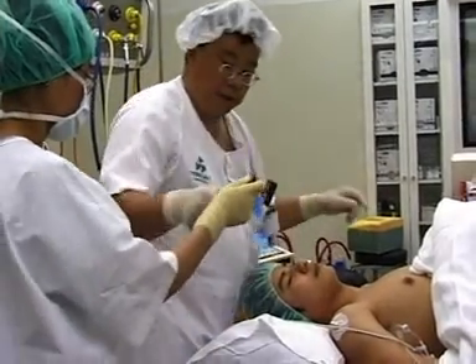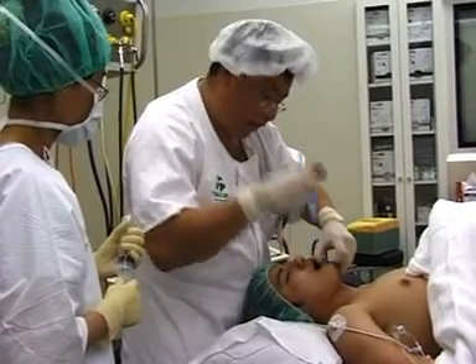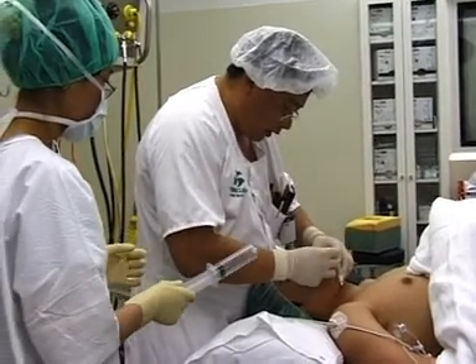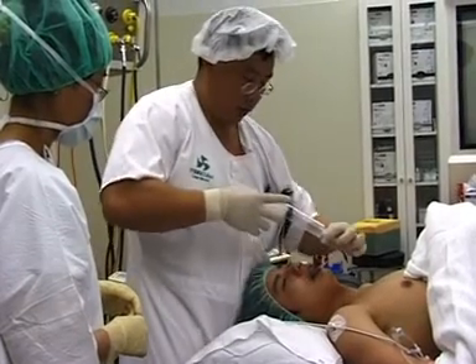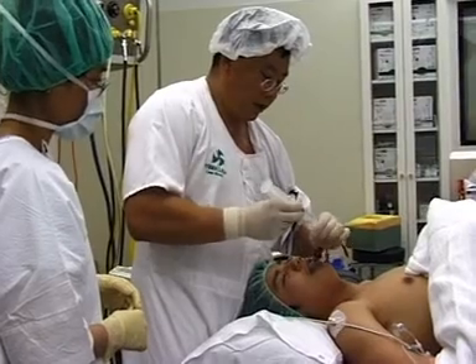What we do is we grasp the jaw and put the laryngeal tube in. Grasp the jaw and lift it forward and seat it firmly in like so. The tube sits in between the two white lines, and then we blow it up — about 100 mils roughly — so we get a good seal.